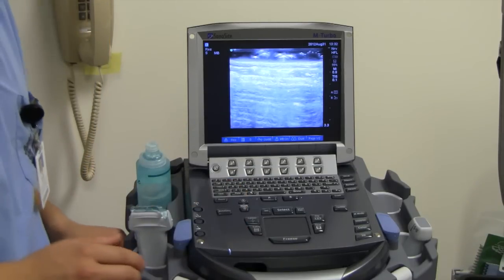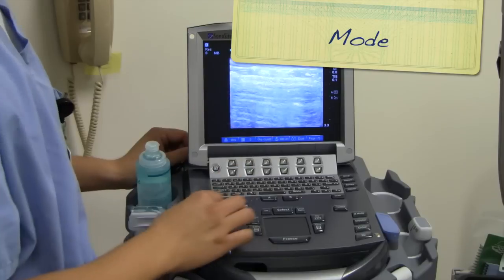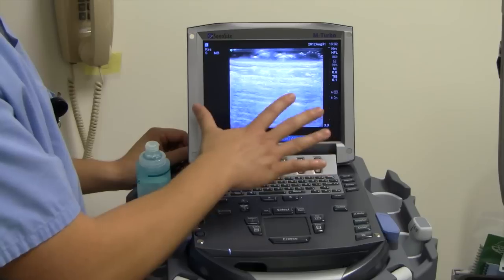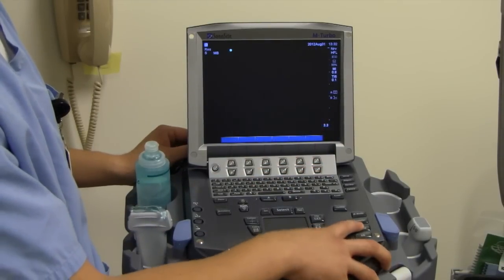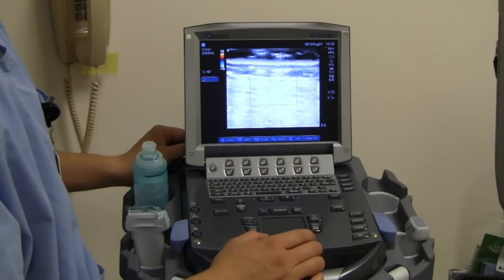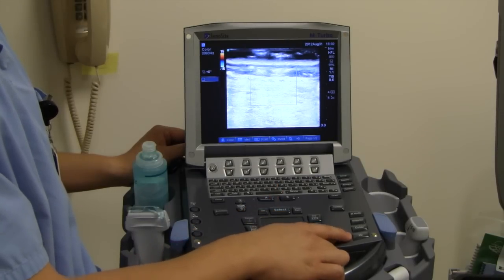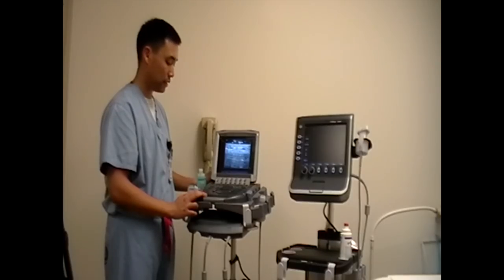The very last thing you have to learn on the ultrasound machine is the mode. This is called B-scan mode, or grayscale mode — you see how it's all black and white, which is what we're used to. There's also something called color mode, which is over here. When you push that, it'll actually detect color, and we'll see that when we're doing more of the vital signs lab. The main two you need to know are just the 2D, which is grayscale mode, and the color mode.